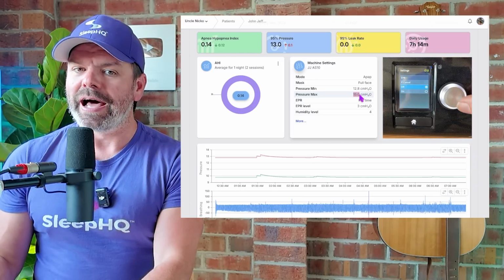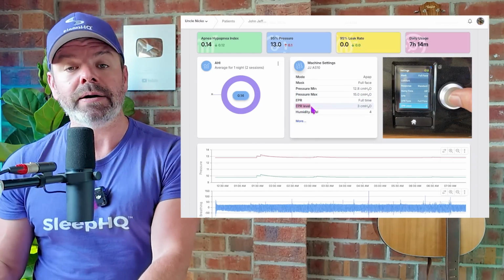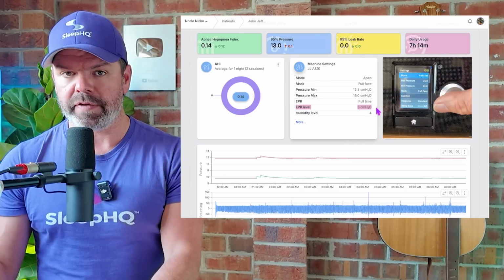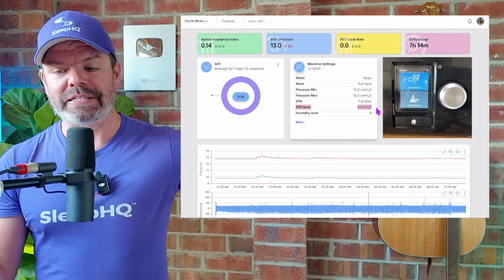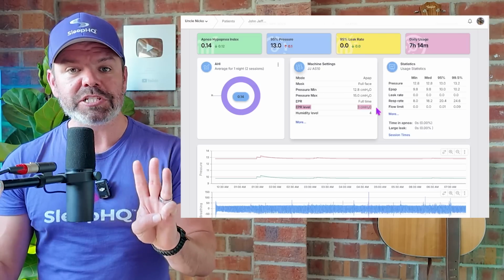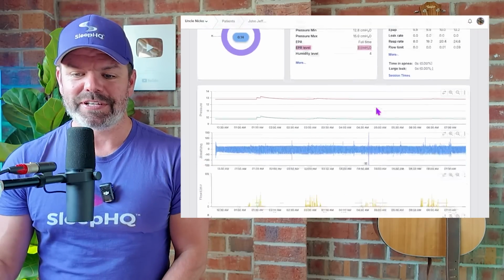Now, he also made another change, which was he switched on his EPR, expiratory pressure relief. And I've done a great big video on EPR. If you want to watch that video, click the link above. But only 3 small pressure changes. But if we come down here, have a look at the results.